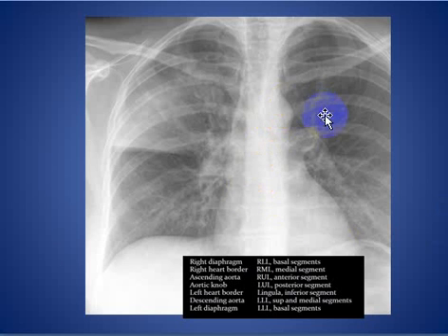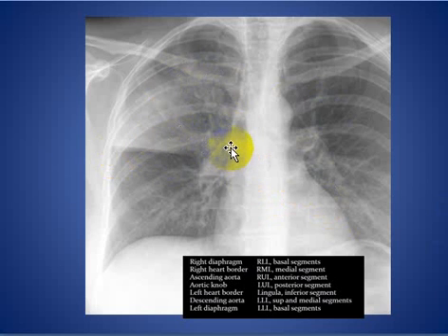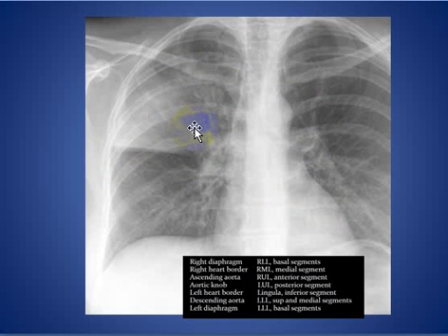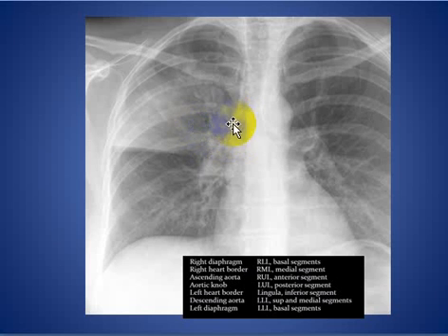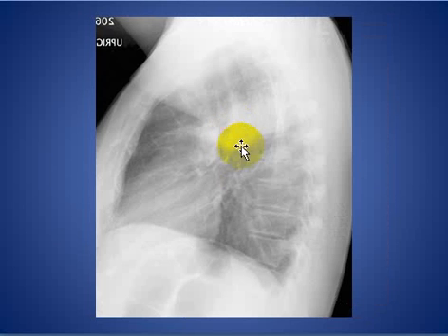Here you see a cardiac opacity, but in this case the ascending aorta region is not obliterated by that soft tissue density. Because it is not obliterating the ascending aorta, the lesion is located posteriorly — if it were obliterating the ascending aorta, it would be located anteriorly. As confirmed on the lateral chest X-ray, this lesion is located posteriorly.